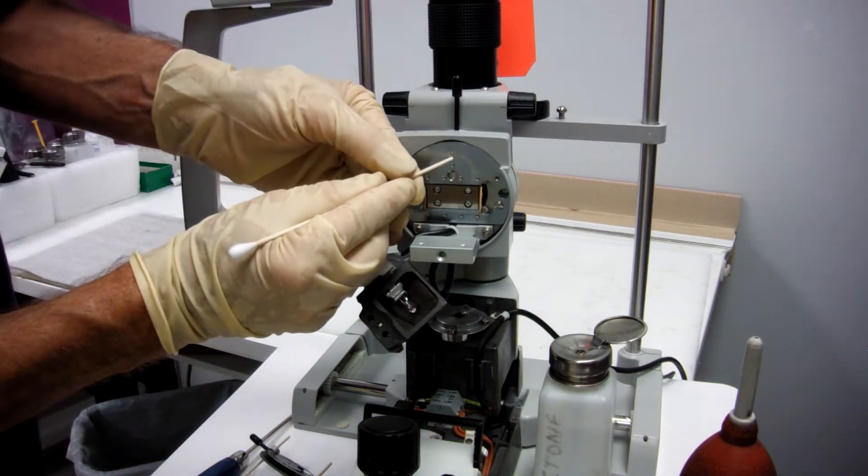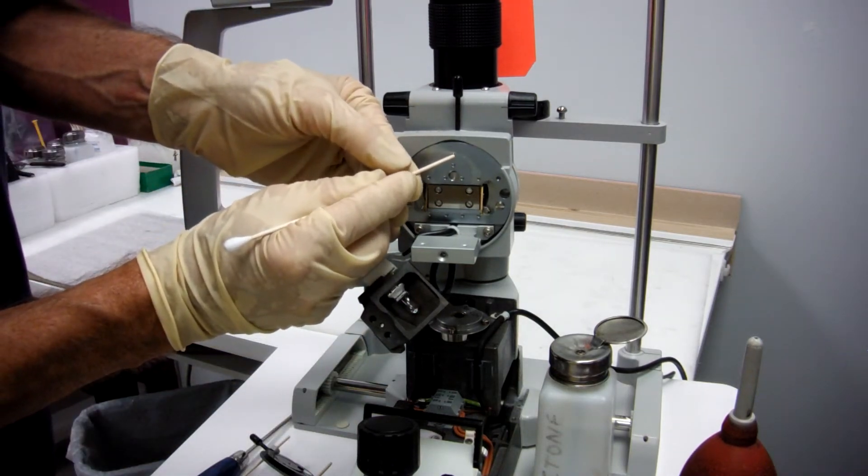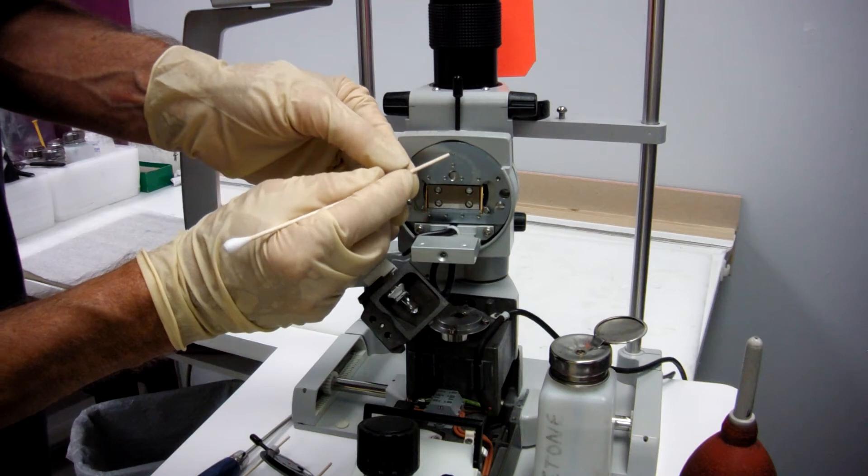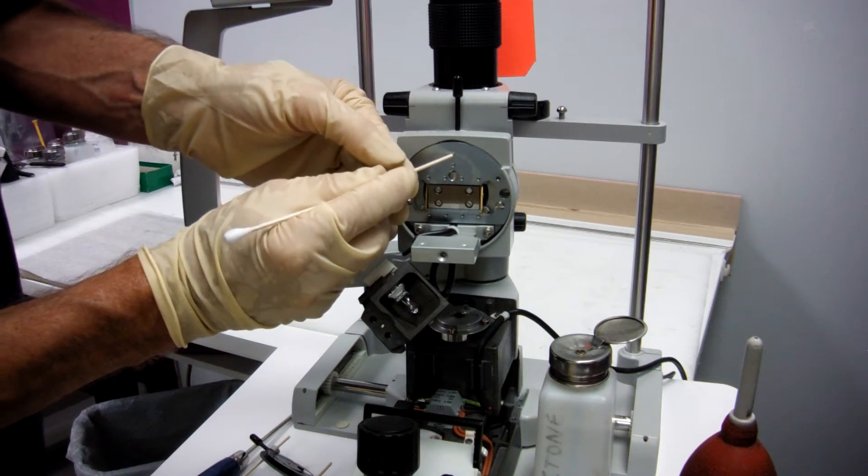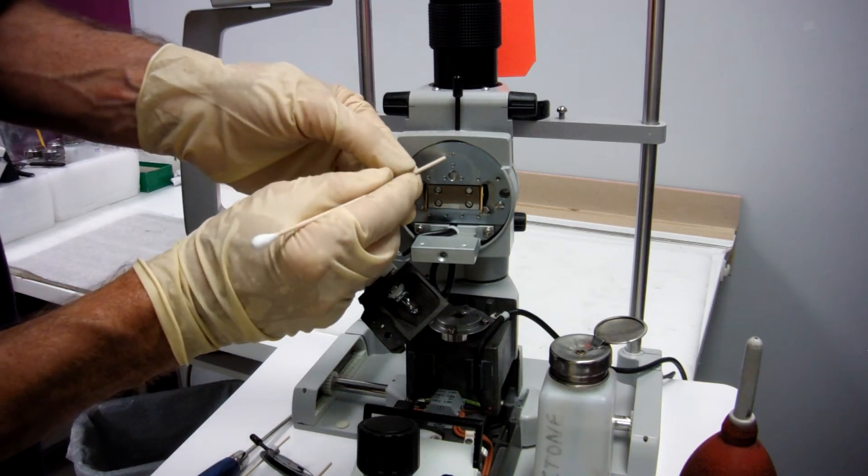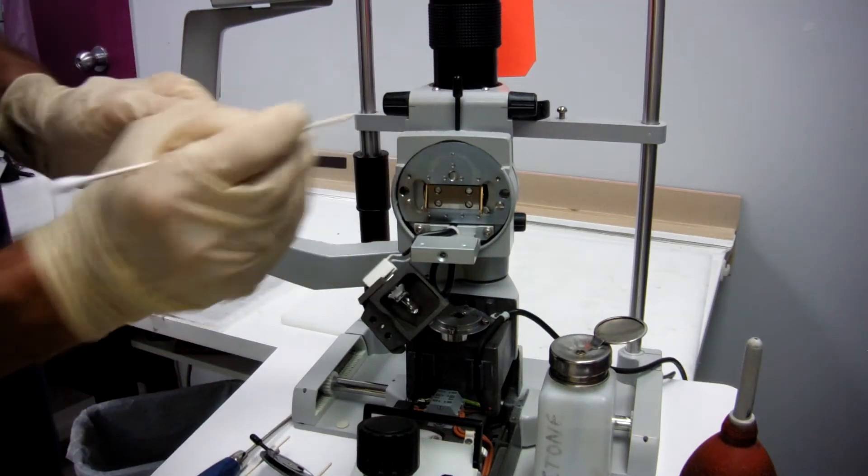Now behind here, this detent, there's a spring and a bearing right there. A small spring and a bearing. It is one and a half millimeters, that little bearing.